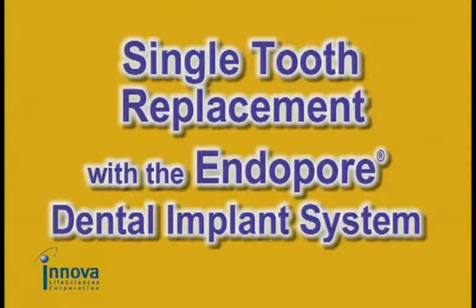The following surgical training video will show a representative example of a single tooth replacement. All implant cases have many of the same anatomical and surgical parameters that need to be applied whether placing a single implant or placing multiple implants.